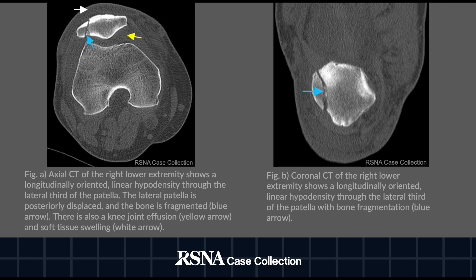The image on the left is an axial CT of the right lower extremity demonstrating similar findings to those seen on the prior radiographs. A linear hypodensity can be seen through the lateral third of the patella. Bone fragmentation is appreciated at the posterior aspect of this linear hypodensity, indicated by the blue arrow. Pre-patellar soft tissue swelling is indicated by the white arrow and a knee joint effusion is indicated by the yellow arrow. There is no osteochondral fragment or loose body, and the knee joint is intact without dislocation.